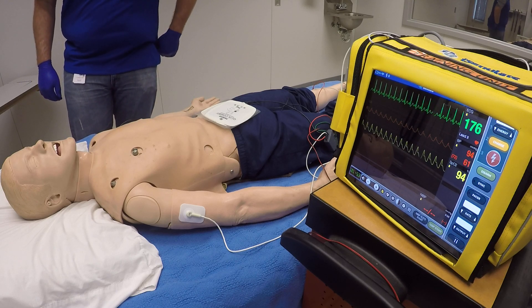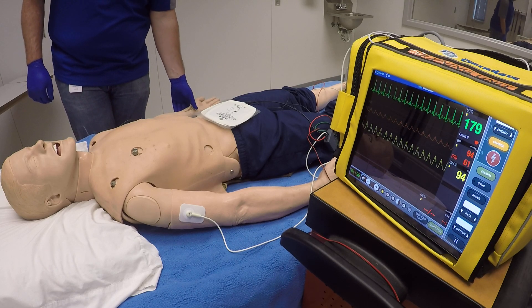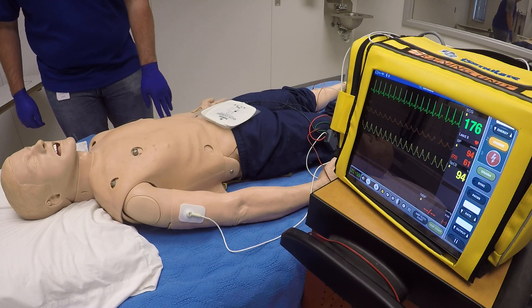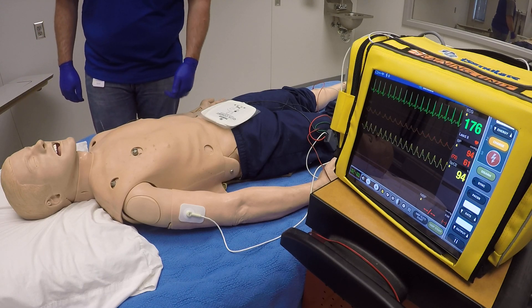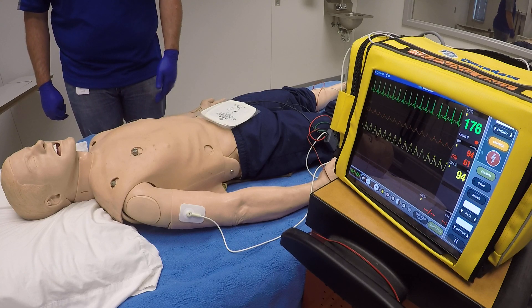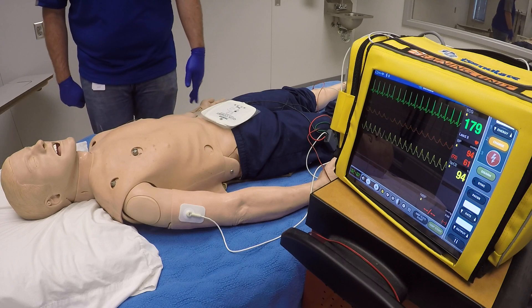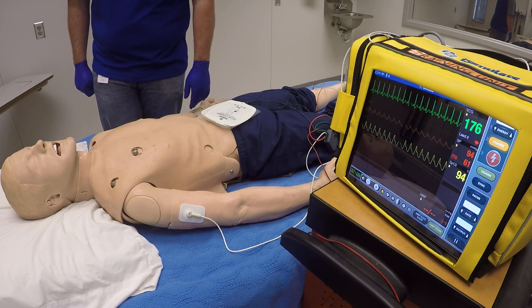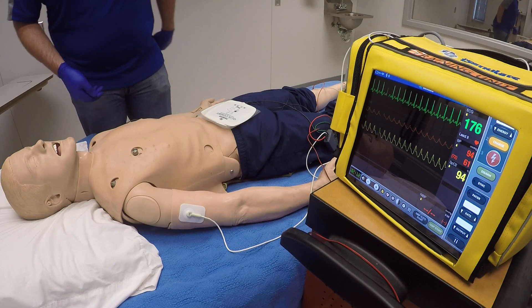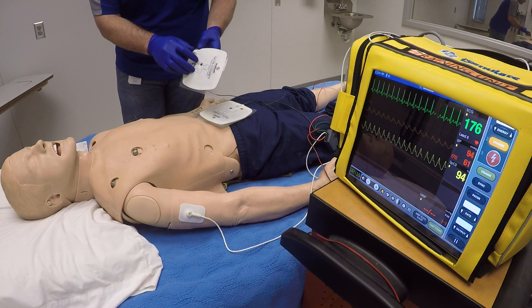We want to ask the patient if they have any known allergies in case we need to use any medicine. Then consider any medication we want to give to sedate them — Versed or Valium, or whatever your protocol has. We already have our four lead on, which gives us our reading, and then we want to go ahead and attach the defibrillator pads.